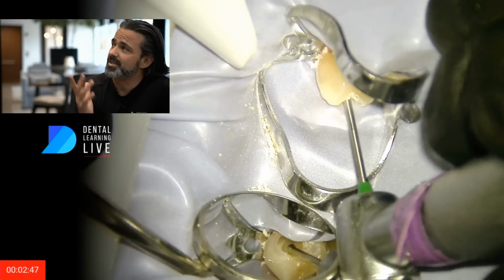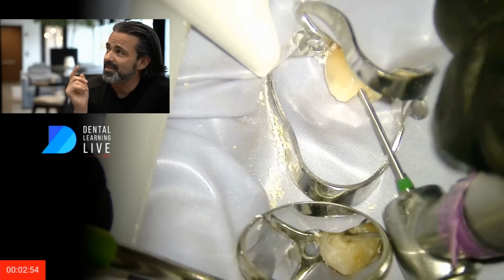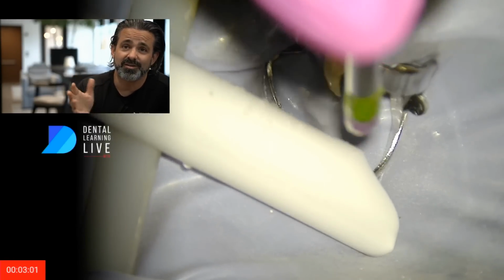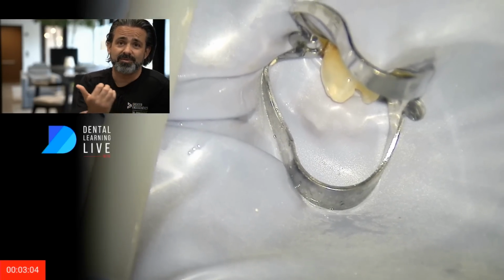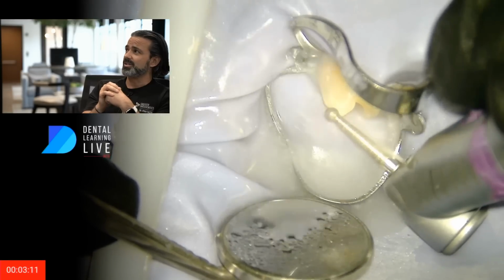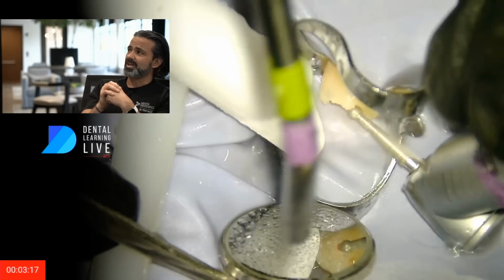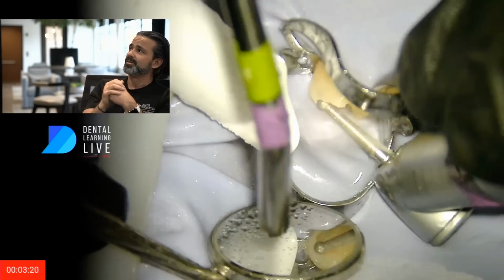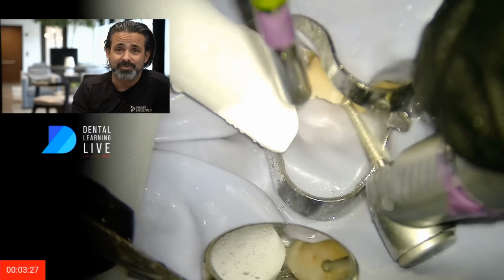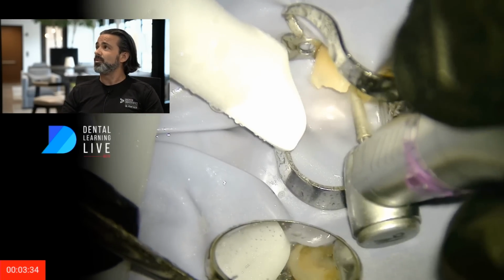One of the things that we all deal with, and restorative guys are going to be more clued into this, is that when you remove that decay, you can see how the enamel on that buccal is really translucent. The idea is, do you leave the enamel shell where it's been undermined from the dentin? For me, that's not something I'm going to do. That's just going to flake off the foundation. So I'm going to remove some of that undercut dentin and bring it back to where there's a dentinal substructure. Because if you send a patient home with that on, they take one bite, part of that enamel fractures off, and then they're freaking out that something happened. So that's what I do. I just try to take it away right now.